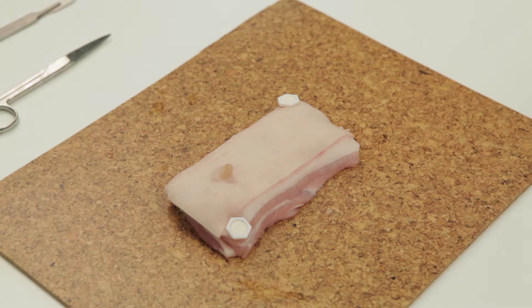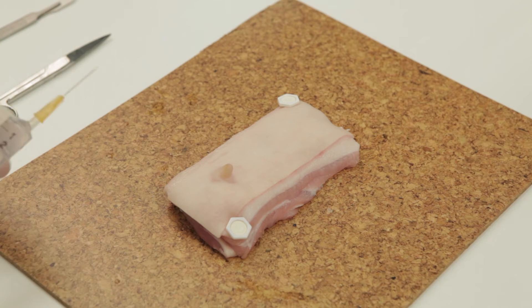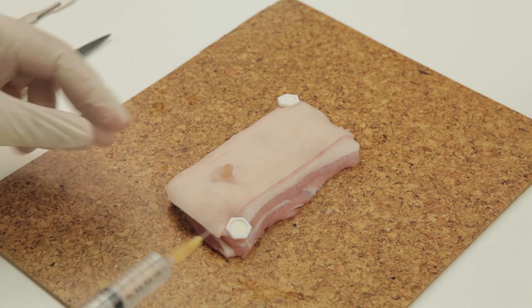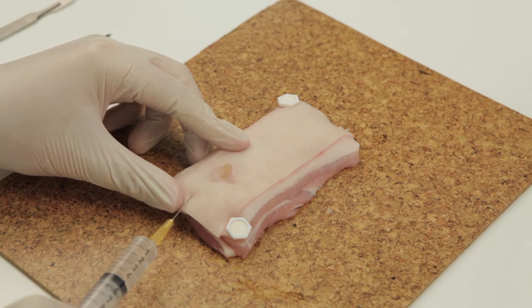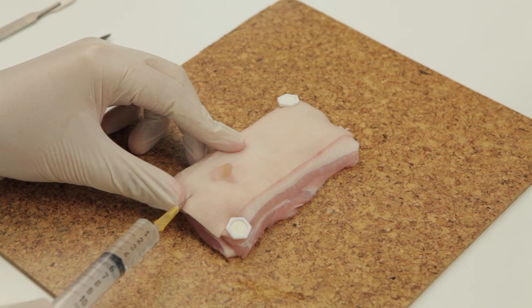To remove a skin lesion, one must first begin by infiltrating a local anesthetic. First begin by aspirating and then raise a bleb around the area to be excised.